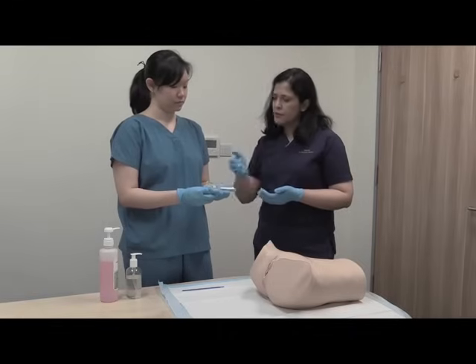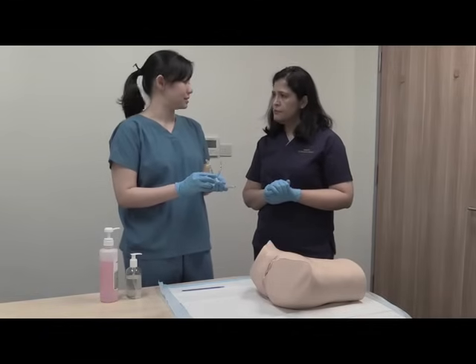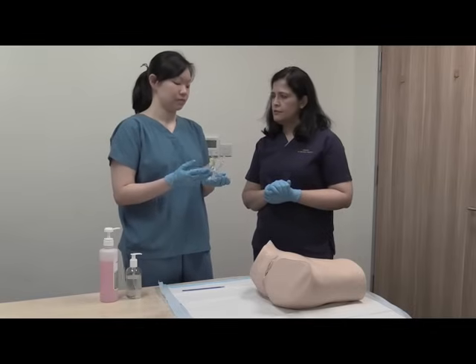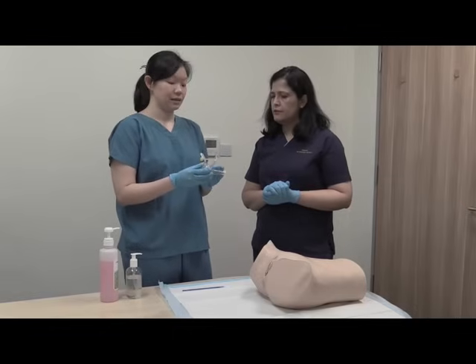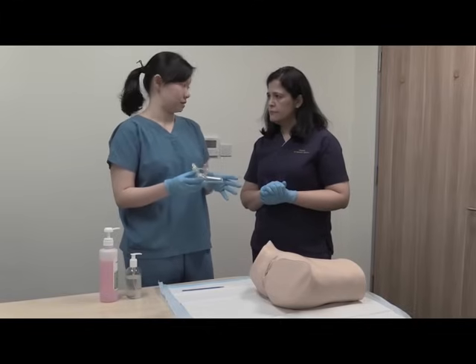There are usually three sizes of speculum available and they are color-coded so that it's easier for us to identify. This one here is the yellow, so-called yellow speculum. It comes in a yellow plastic bag and is considered the medium-sized speculum. There is a smaller size which is pink, and a larger size which is green.